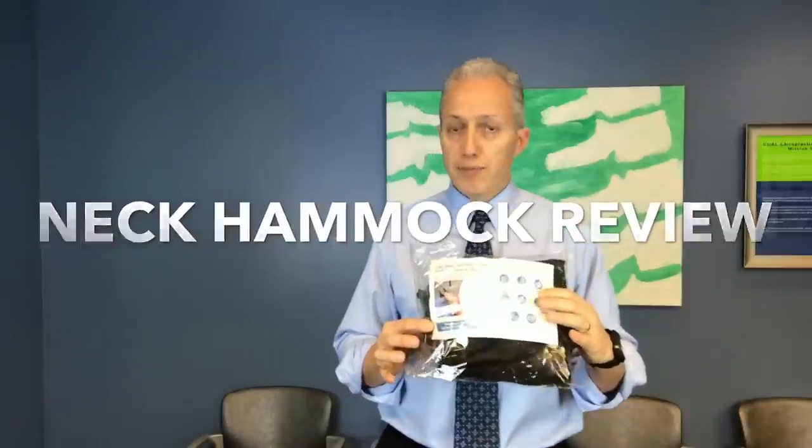At the request of one of my patients, today I am reviewing the neck hammock. I've been seeing this all over Facebook, all over Instagram, and I wanted to find out for myself if it works.